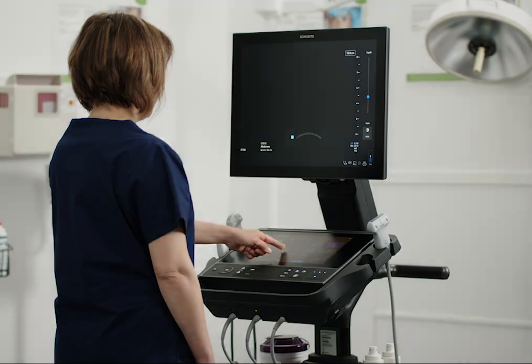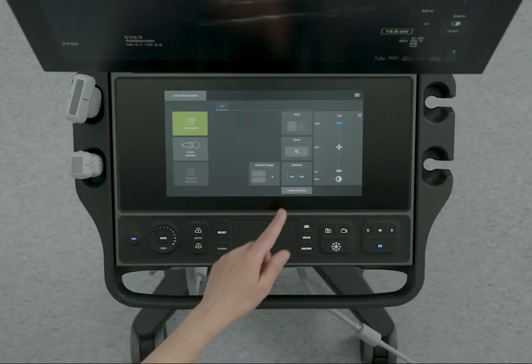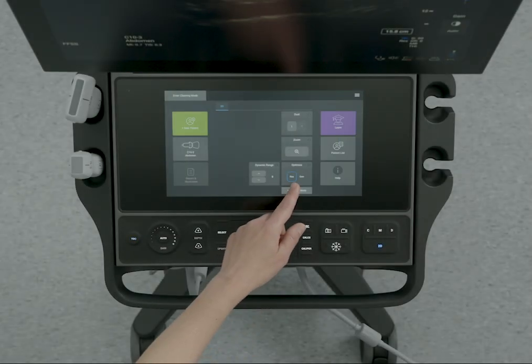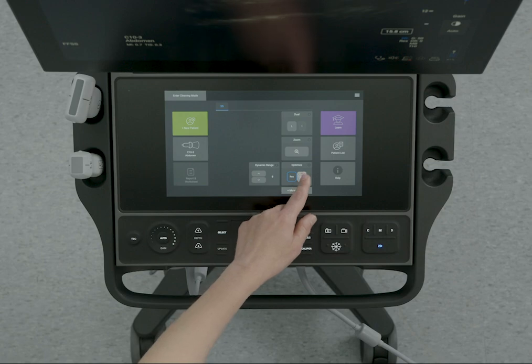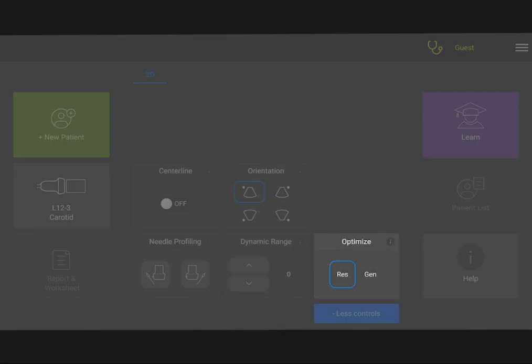The Optimization control automatically optimizes your image if you need to scan shallow or deep structures. Tap Res for the best possible resolution.